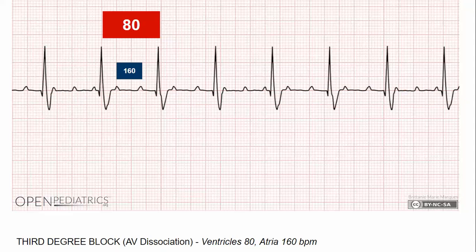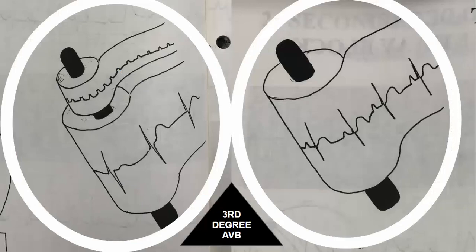Now, I created this illustration a long time ago, and I've been waiting to use it, so let me show you really quickly. It's a kind of humorous illustration now, but back when I was making it, I thought it was pretty cool. Imagine a rod with a roll of toilet paper at the top and a roll of paper towel at the bottom.